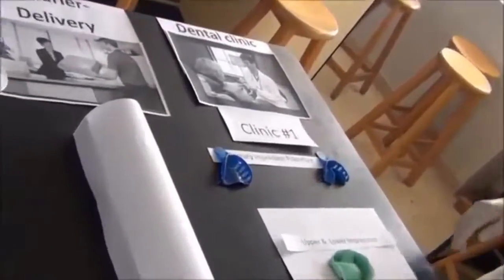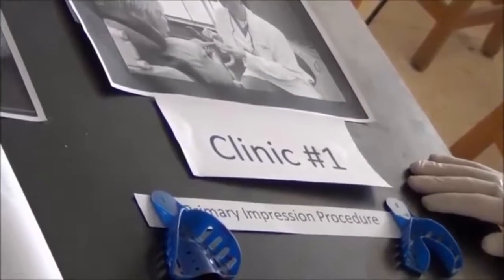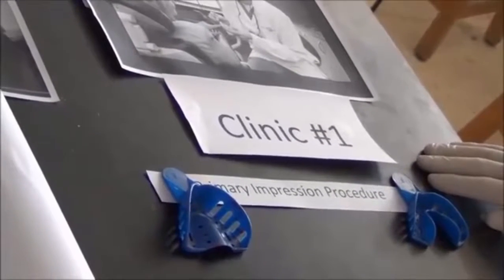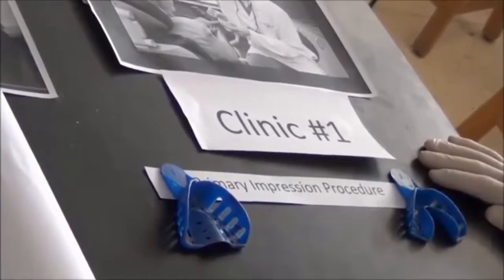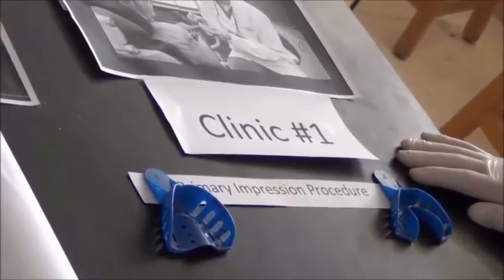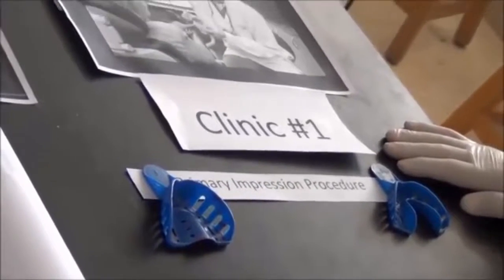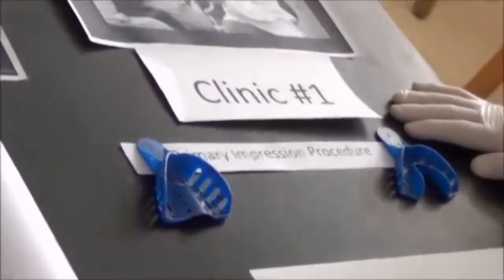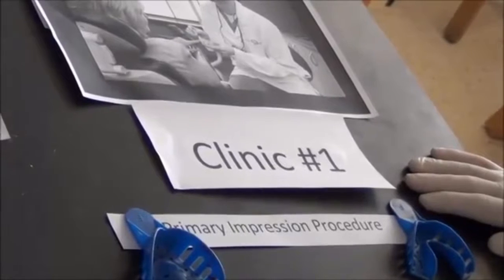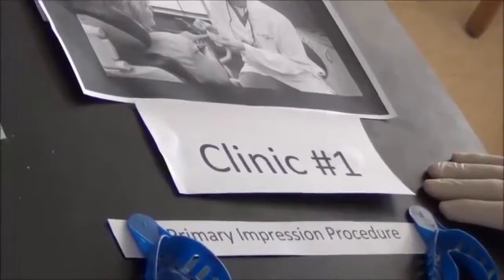The dentist has decided that this patient is suitable for a chrome cobalt RPD. Remind you that chrome cobalt is a definitive treatment, meaning that the patient should have finished all of the procedures before it, stabilizing his oral health, removing teeth that should be extracted, treating his periodontal diseases if he has any, and treating active dental caries. So chrome cobalt is a definitive procedure. So all of the dental procedures prior to that are not counted here. We are talking about clinic number 1 of the actual RPD procedure.